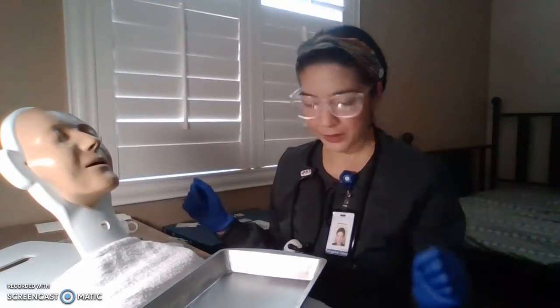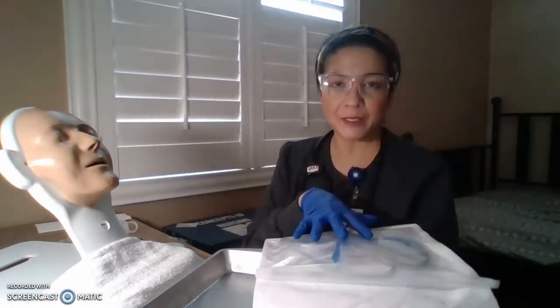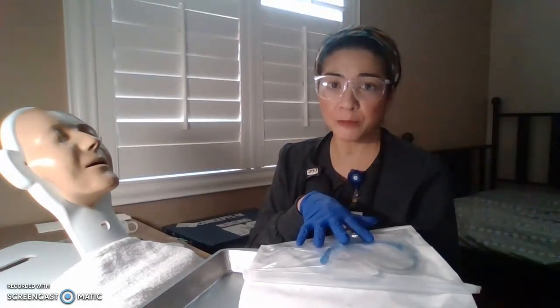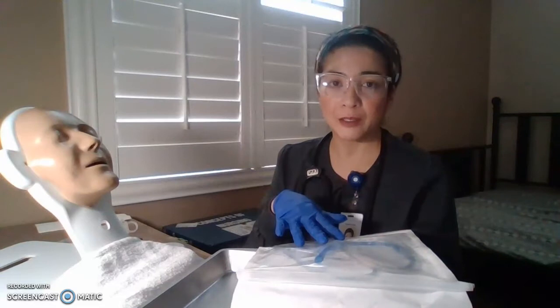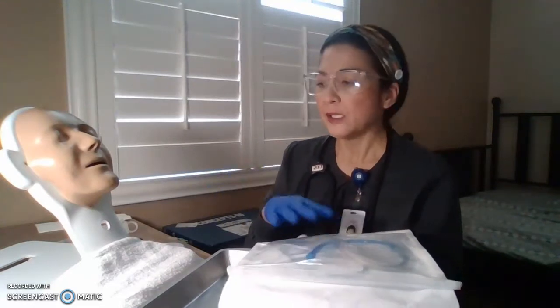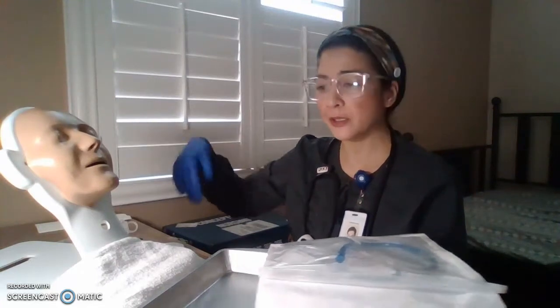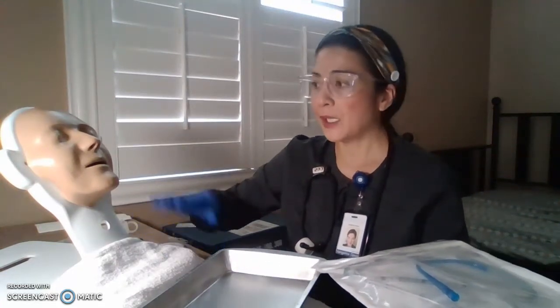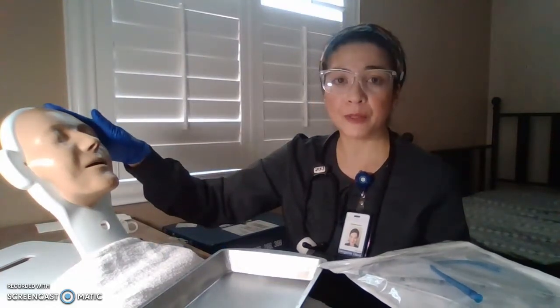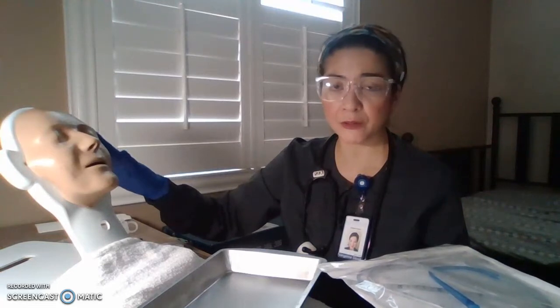All right, so now let's get our tube. Sometimes this is placed in warm water just to make it more pliable for the patient, okay, upon going in. So now we have given privacy for the patient, making sure that he is comfortable, number one. And usually the patient would be in a high Fowler or semi-Fowler position, whichever is tolerated best.